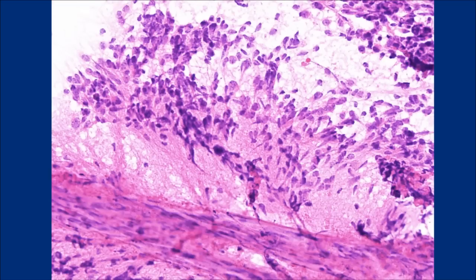As in many other grading systems that we have, mitotic activity, proliferation, is the key feature that we use for grading. Pleomorphism, as I showed you in a case of a giant cell ependymoma that has these really large bizarre cells in the spinal cord, that tumor is low grade. So pleomorphism you often see in many different tumor types in the CNS, but the proliferation is what we use.